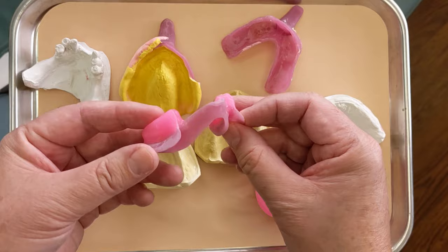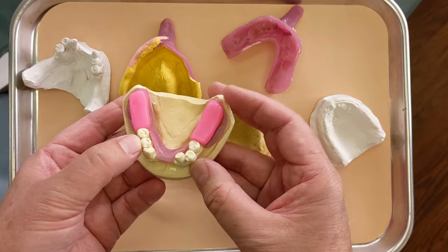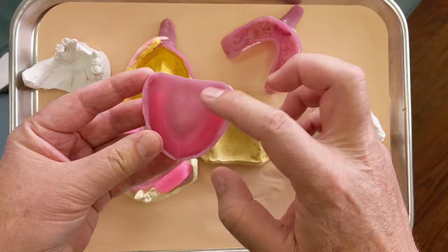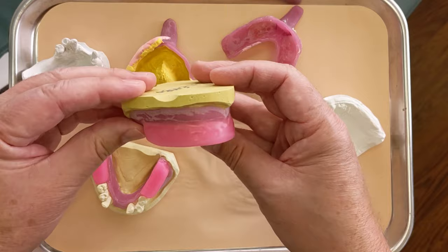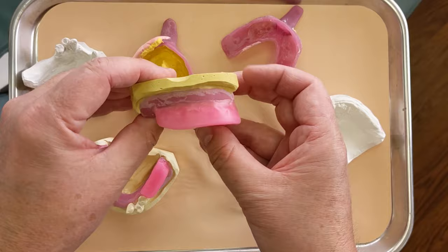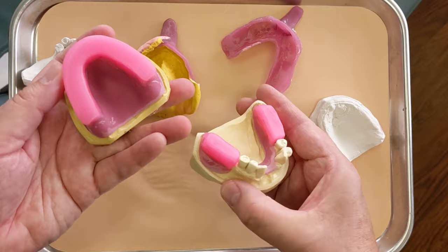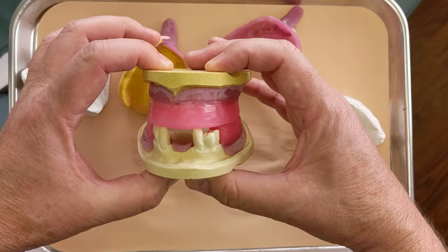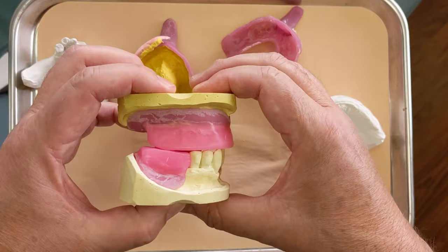On those models they made the bite rims — just a shell of plastic that fits on the jaw with some wax on it, and the wax is where the teeth are going to go. Same thing on top: a plastic rim. This isn't going to be part of the final denture; it's just for doing the bite registration. The lab set the wax to indicate where the teeth are going to be. For this visit, I'm going to adjust the wax based on the patient's face and bite, and we're going to be taking a bite relation so that the lab will know how the patient's teeth fit together. Without it, the lab would just be guessing — it wouldn't be super accurate.